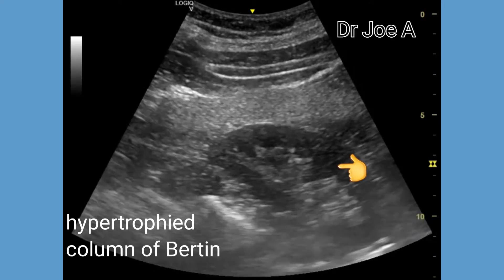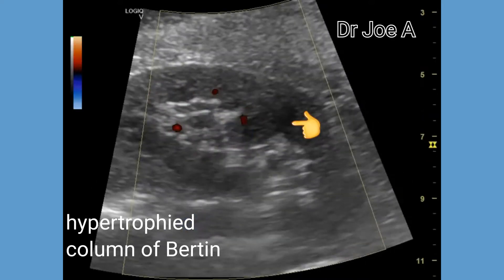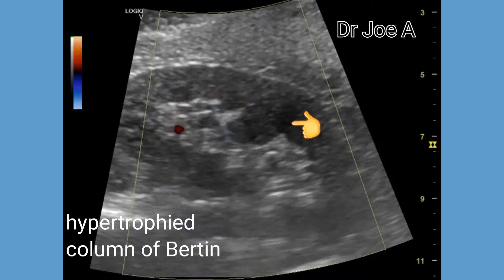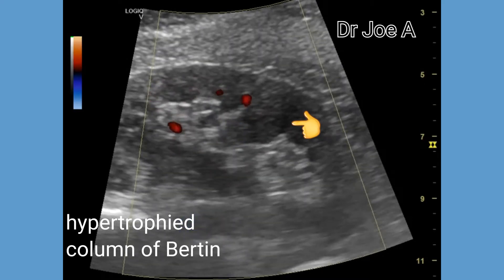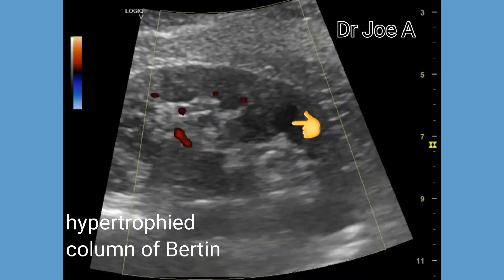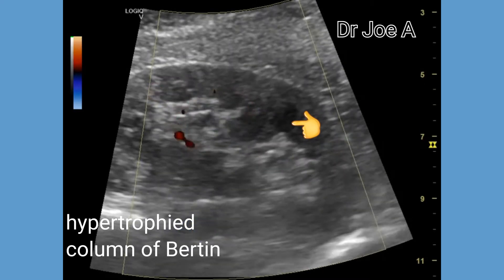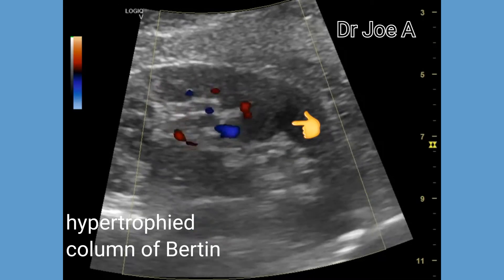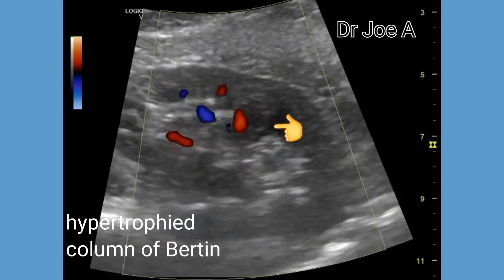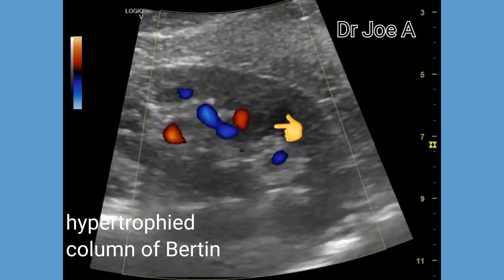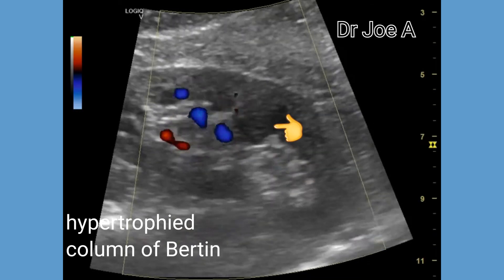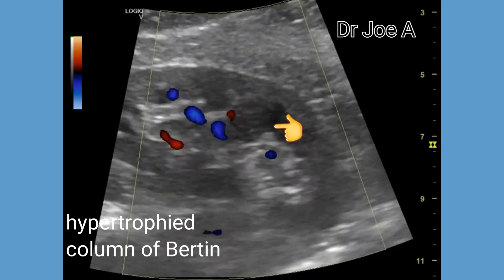On colored Doppler ultrasound, we can see normal vascularity in this region, which rules out any neoplastic growth or malignancy. There is no evidence of neovascularity in this region.